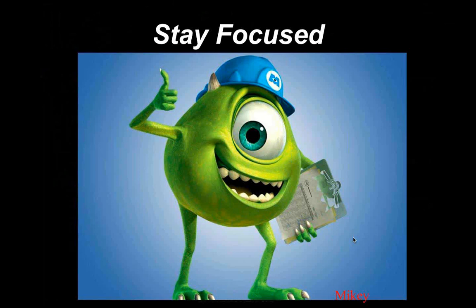Yeah, very good case. When it comes to piggybacks, what you mentioned really supports the work that Barry Weissman has done to look at oxygen transmission through a piggyback, that you need a Hyper-Dk soft lens with a hyper-Dk GP on top of it. And what's so neat about piggybacks today, when I was in optometry school and my mentor liked piggybacks, back then it was a 5 Dk Polycon on top of a Bausch & Lomb U lens. So it was really like an edema sandwich. Yes, I remember. But at that time, you really saw the benefits in terms of being able to provide comfort and vision to those patients.